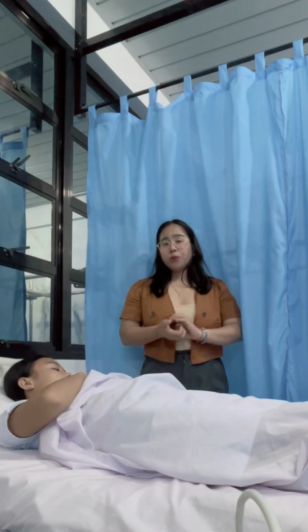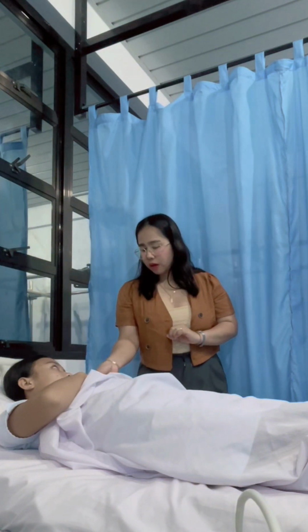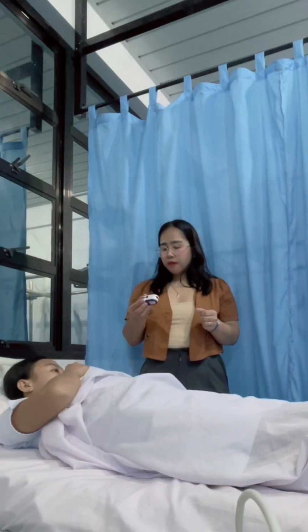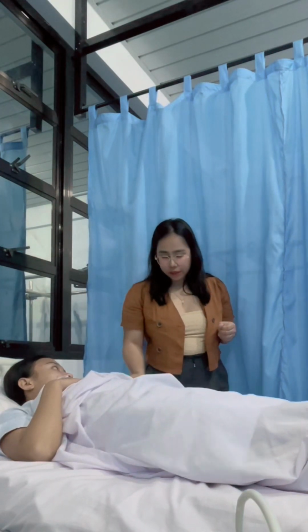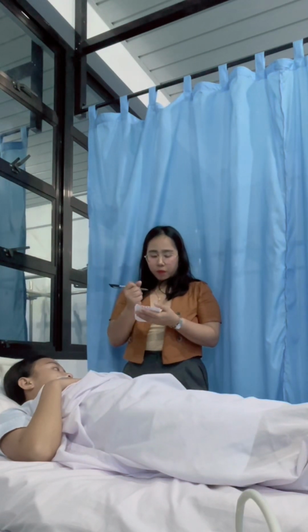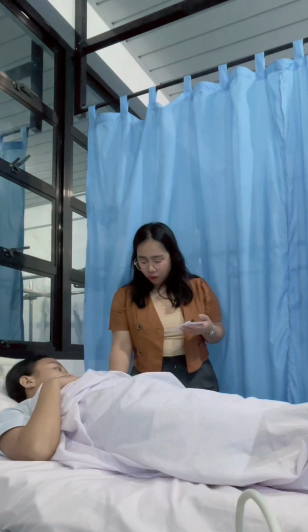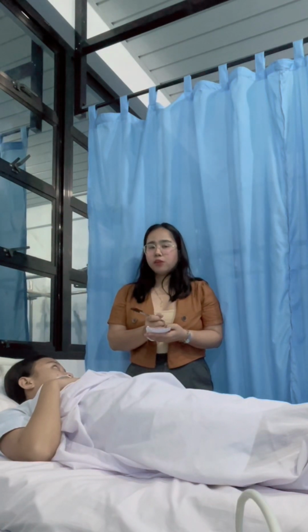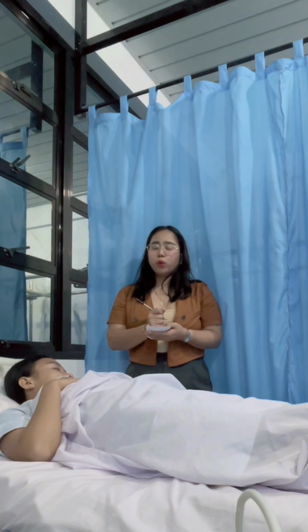Okay, I'm done counting her breathing. Let's remove the pulse oximeter, and then let's document the result of the patient. So the patient's RR is 8, and let's multiply it by 2.